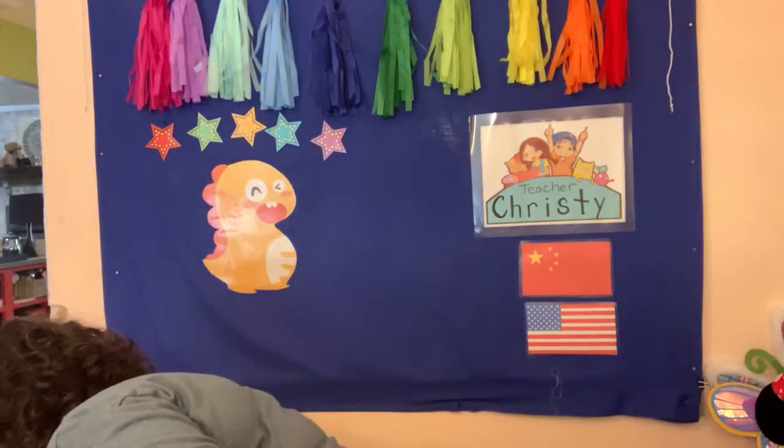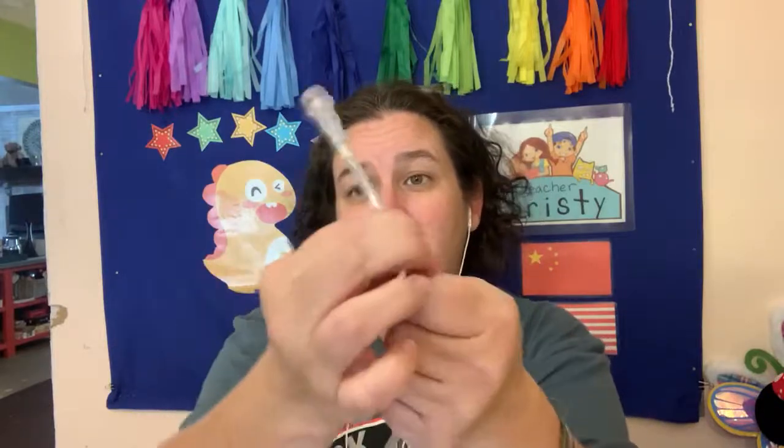All right, so the Venturi device in the lecture PowerPoint, I was talking about the orifice size, fixed and variable orifices. So with, where's my simple mask? With the simple mask, you attach this to the flow meter, and that's the orifice. That is the orifice size. It's fixed. It's one size fits all. So if you have 3 liters going through this tubing, the pressure is lower than if you had 10 liters because you're shoving it through a smaller space. All right, so that's a fixed orifice.